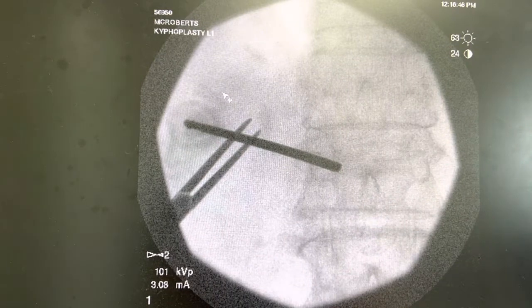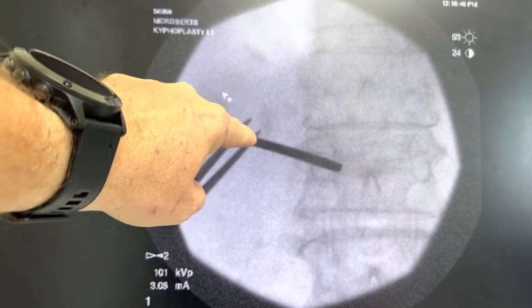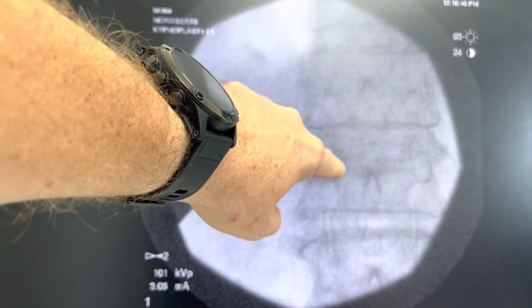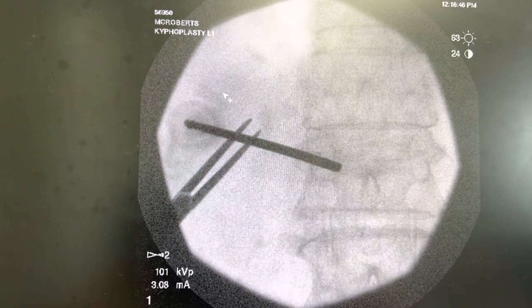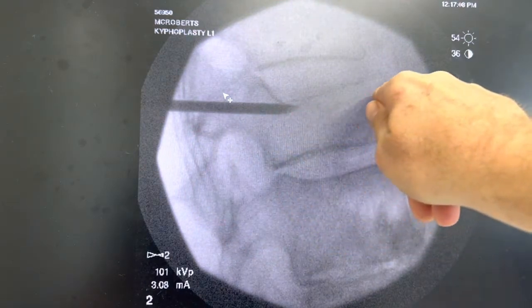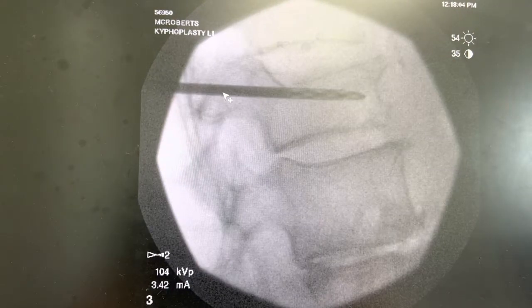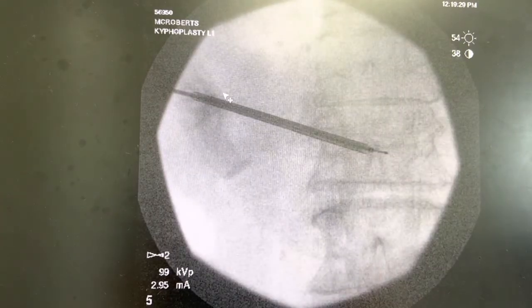So this is kind of how it works. You can see here we've got the trocar — we start over here going through the skin and then we gradually come and touch the bone. And then as we go forward anterior, we pass through what's called the pedicle. And then once we're in the body, you can see it's coming towards the middle of the body. This is the body with the fracture here. That's our aim. So next, you can see from a lateral view. Now we've gone and the fracture is right in here, and that's where we're trying to fill this area with cement and then push this up a little bit. You can see as we go down, now we're using a little drill to advance. That's the balloon before we have any contrast in it.